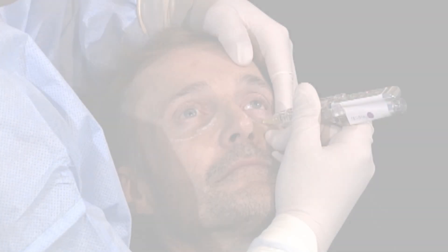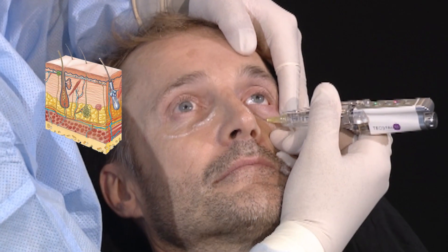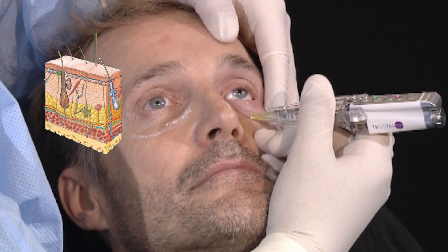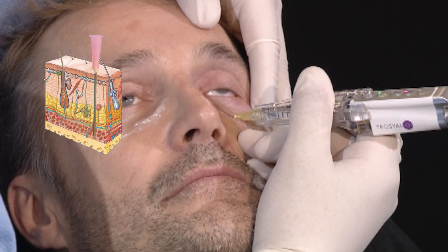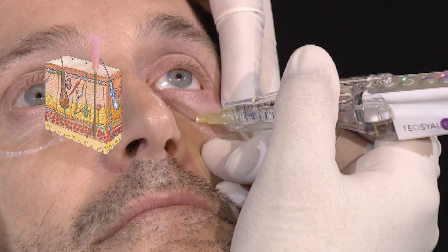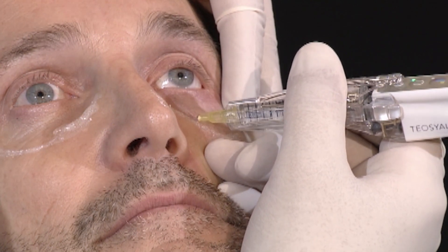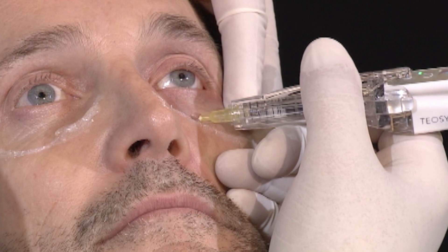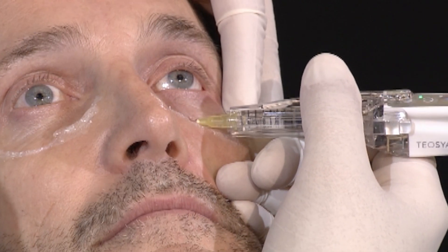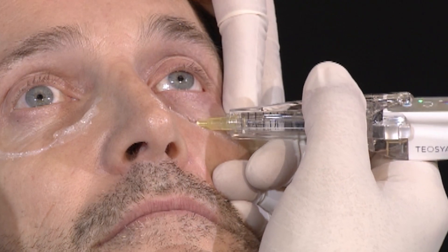You saw it with the previous injectors. You must do it very near the bone, in the submuscular area, and then I will inject the same quantity with this point, and I can do it higher. With my needle, I feel the bone, and I inject the product.